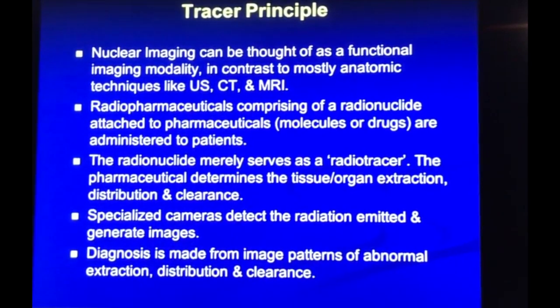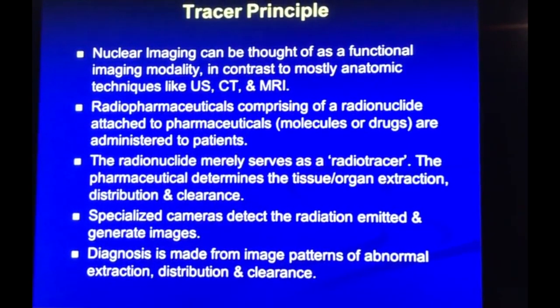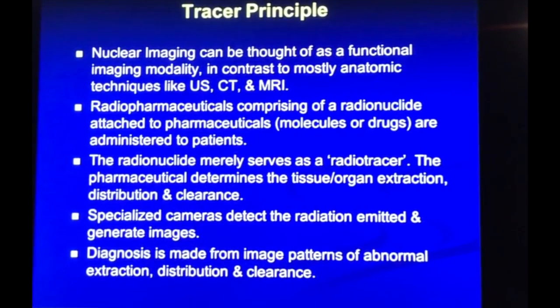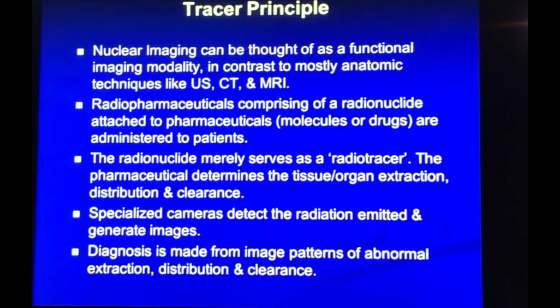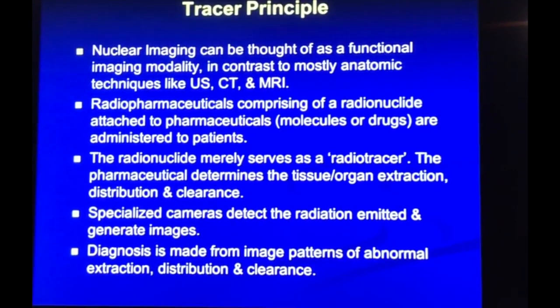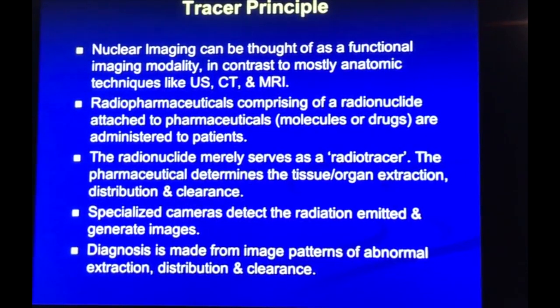The radiation emitted from the patient then gets captured by the cameras, and using complex computers and electronics, we get the images that are used for interpretation. And diagnosis is basically recognition of imaging patterns of abnormalities in extraction, distribution, and clearance.